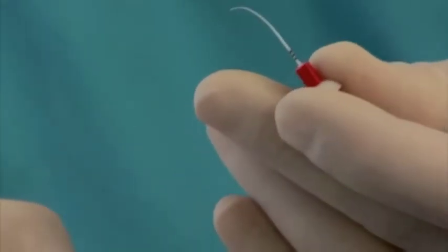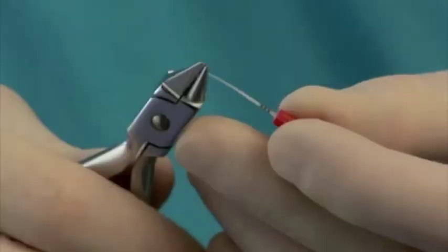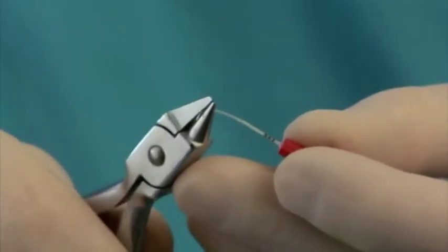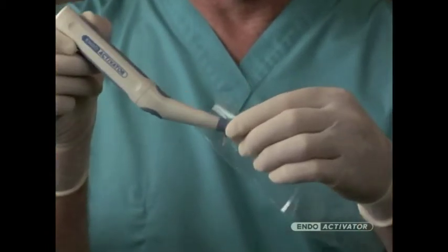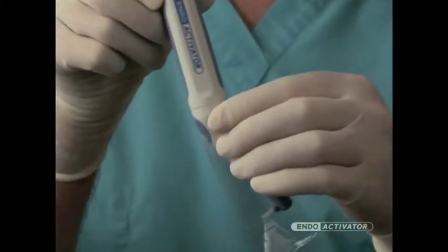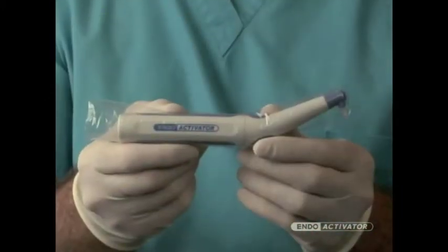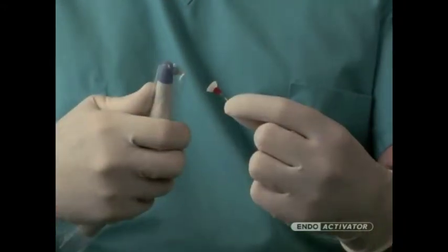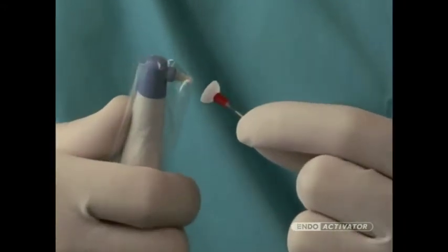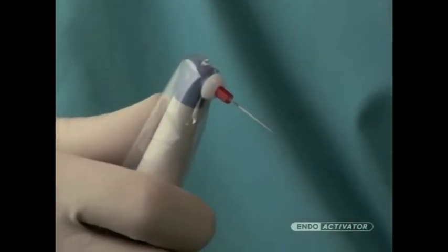At times, it may be helpful to pre-curve an EndoActivator tip to facilitate placement. In these instances, orthodontic bird beak pliers can be used to place a smooth curve. Place the barrier sleeve over the driver to protect the entire handpiece. Importantly, attach the activator over the barrier-protected driver. The activator should snap on firmly, promoting a secure connection with the handpiece.